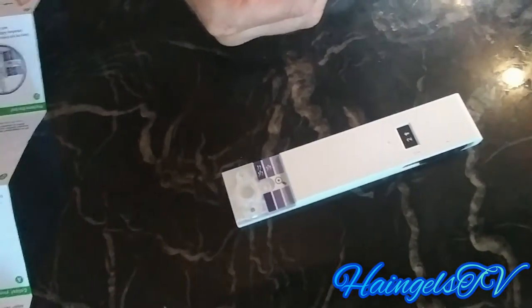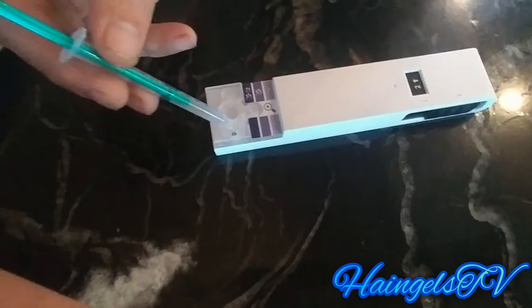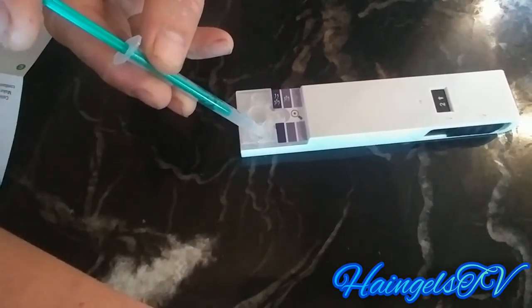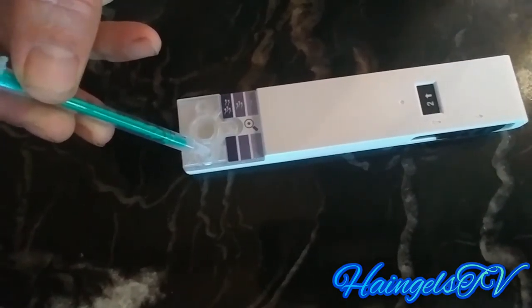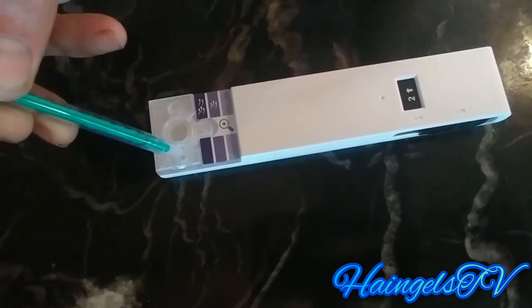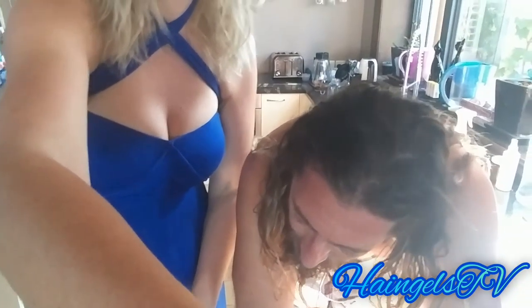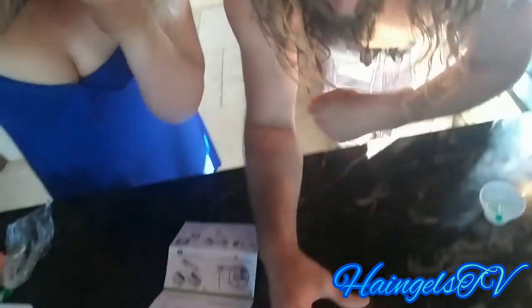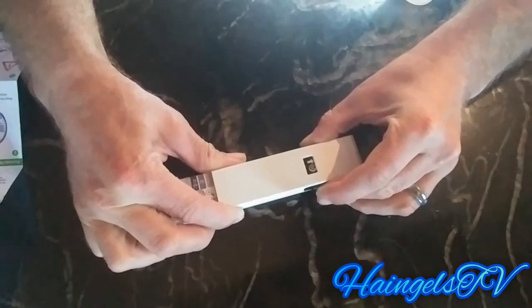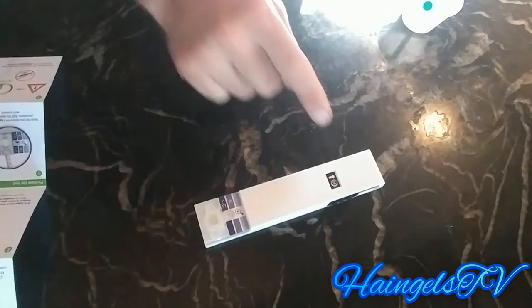It says keep the test horizontally throughout the test procedure, slowly drop it in — down into that little hole. Push the slider all the way forward towards the sample until you hear a click sound.